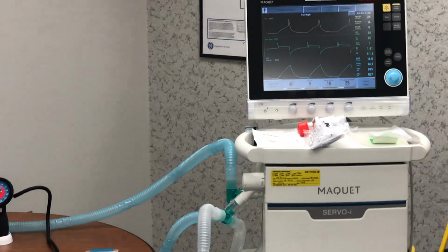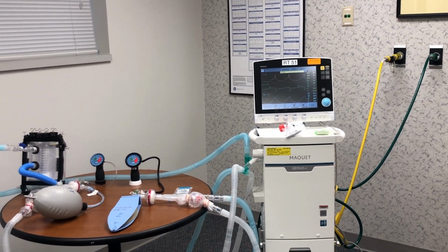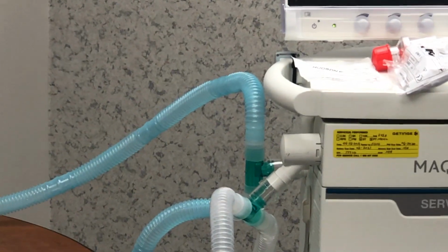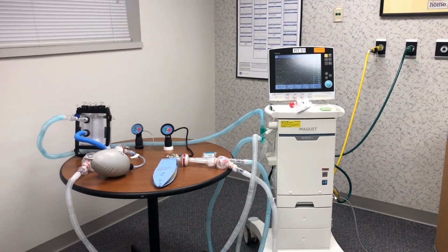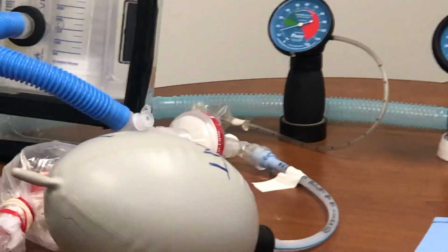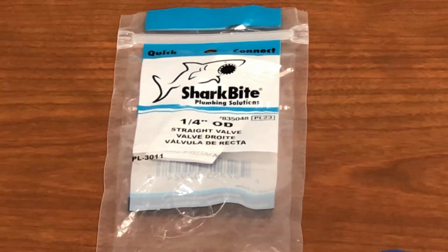So again, if you see the tubing, the blue tubing is the inspiratory limb and the white tubing is the expiratory limb. What I have done here is basically I have added a T-piece here, and this is very simple and available anywhere. And the other important thing I would like to point out in this setup is everything except this ball valve, which is the blue valve here, and the blue valve here, is basically available in any departmental store.